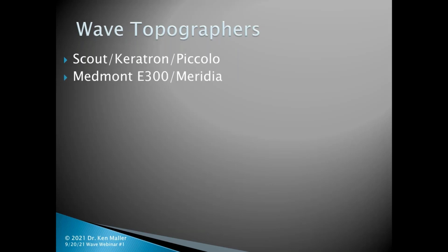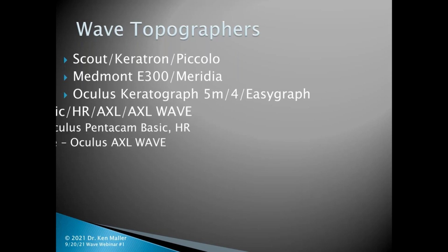The Medmont, a lot of people are using the Medmont, and there are subtle differences between the way the Scout and the Medmont talk with WAVE, and so it's important to understand those subtle differences. The Oculus Keratograph, both the 5M, the 4, and the EasyGraph are all compatible with WAVE, and again, that talks to WAVE actually in a different way.